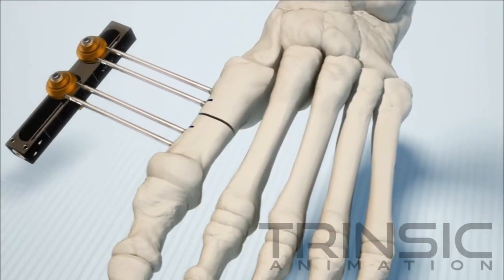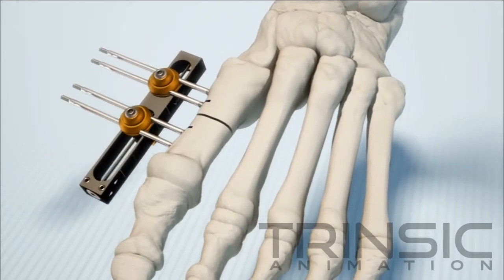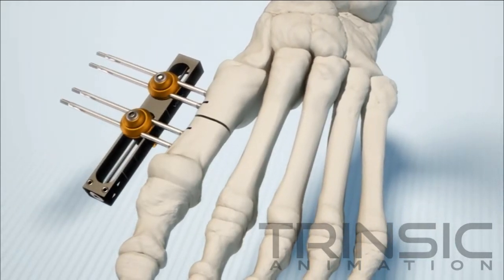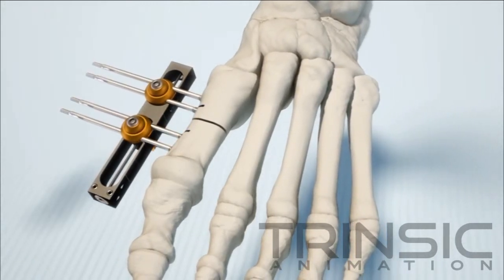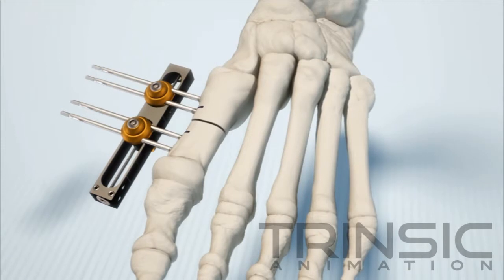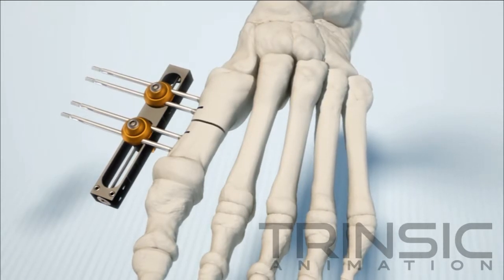Reengage the mini rail to the pins and gently tighten the two locking screws on top by hand. Again, tighten the screws without locking them. This allows the rail body free movement so that it can be aligned parallel to the metatarsal shaft.